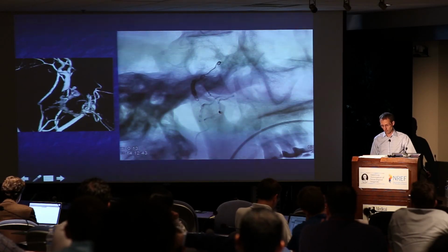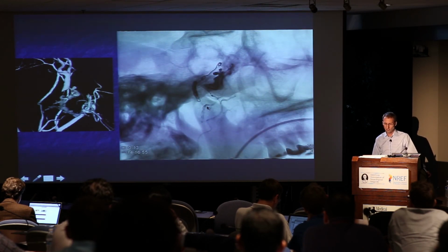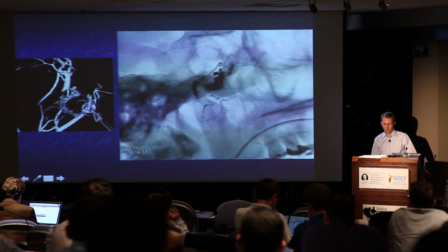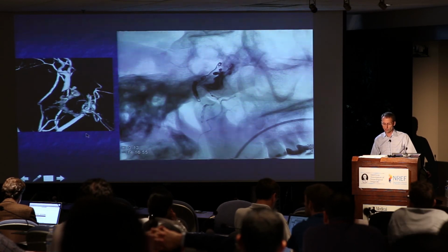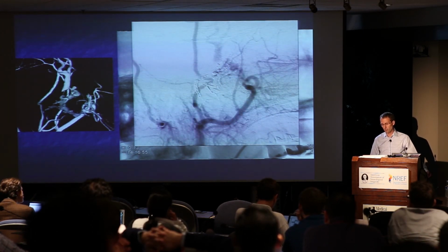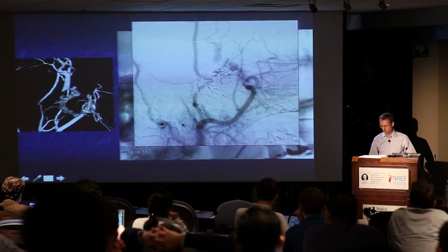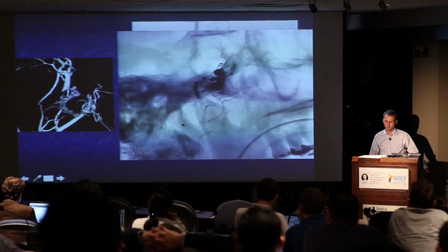I'm just going to show some selective images from this. The tip of our catheter is about here. We've had some reflux that we had to be patient to allow. Ultimately, we were able to get this going forward into the fistula pouch. You can see the different septations here that correlate with the fistula pouch. We thought we had done pretty well at this point. We do a surveillance angiogram, and again, you can see that the cortical venous drainage is still present, so the fistula is still filling. It allows us to continue on.